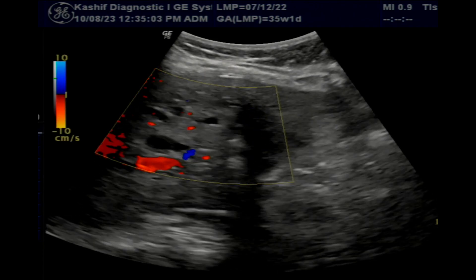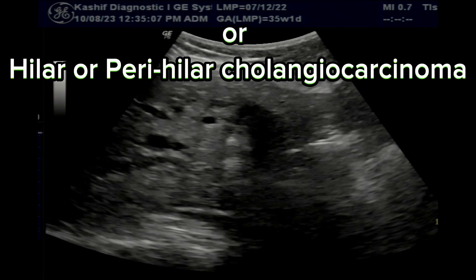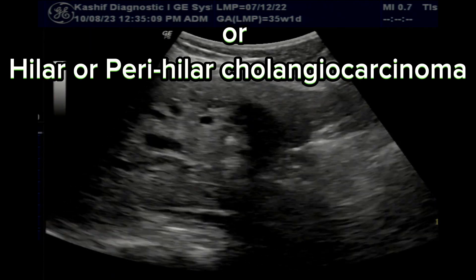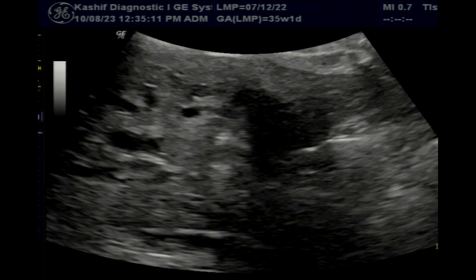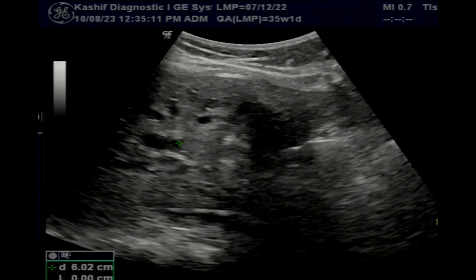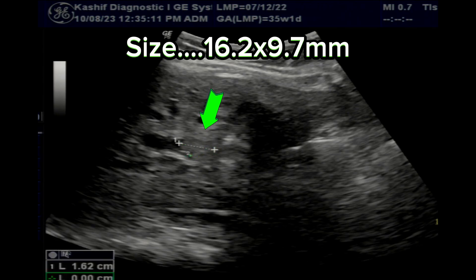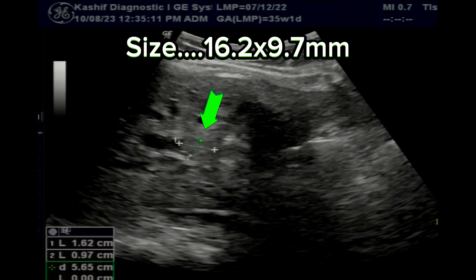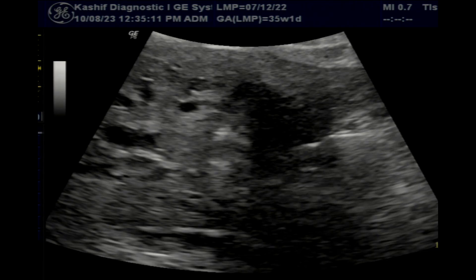This is the Klatskin tumor — hilar or perihilar cholangiocarcinoma — occurring at the bifurcation of the common hepatic ducts. These tumors have aggressive behavior and tend to obstruct the intrahepatic bile ducts. Due to its small size and poor visualization on ultrasound, MRCP is the standard imaging modality for diagnosis of cholangiocarcinoma.